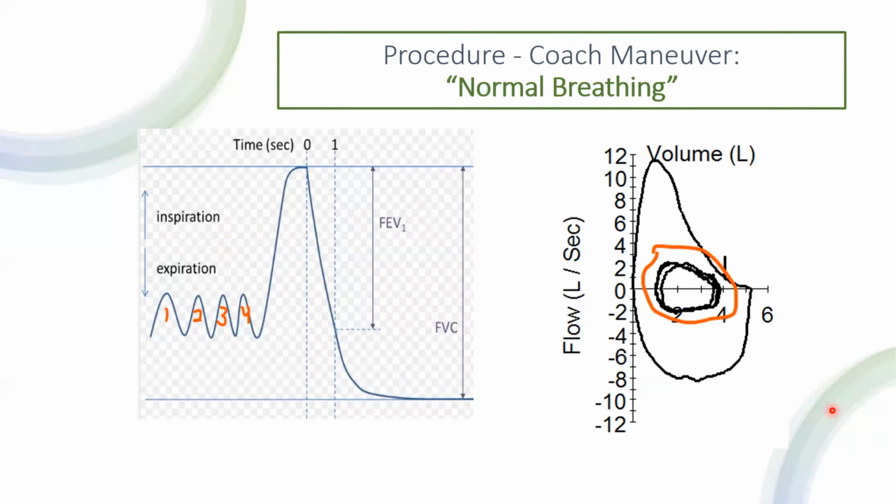All right, so we're going to tell the patient normal breathing, breathe normal, resting, easy breathing. Nice tidal breathing. You're going to use the volume time graph of multi-breaths to watch for similar size and shape tidal volumes evenly spaced. Clear out the inconsistent breaths, particularly when they're first learning to breathe through the machine and getting to be at rest with that.